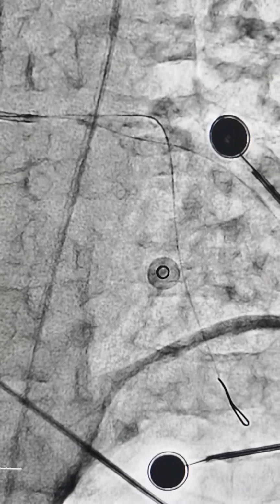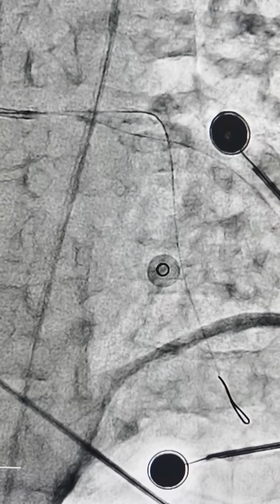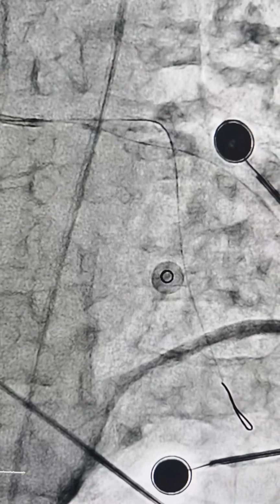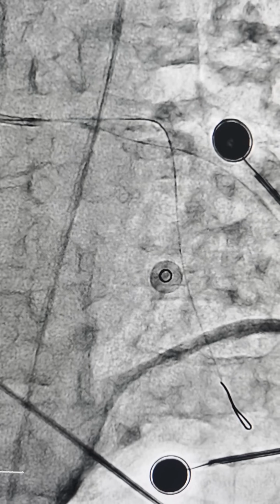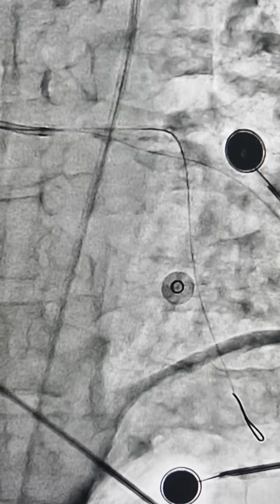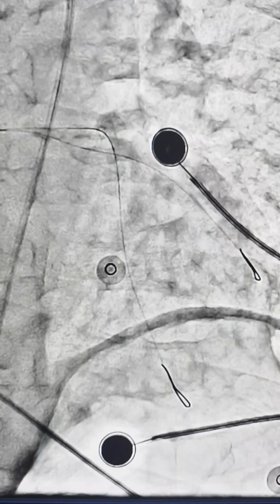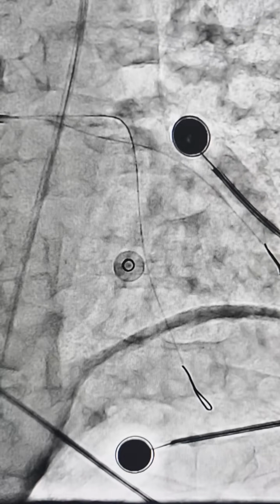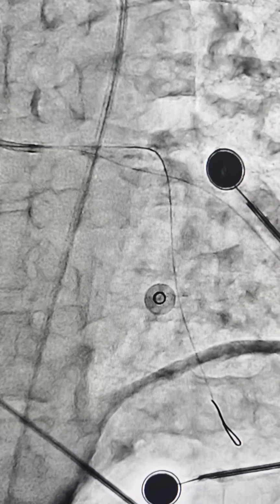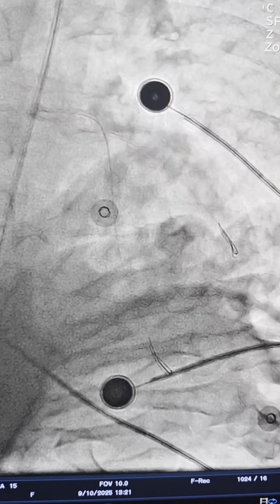We intubated him, and while we were intubating, we put in a sheath, and the pressures were 60 systolic, broad complex. So I quickly intubated him, and these were the wires, two wires. You can see that the heart is at a standstill, and the CPR is going on. So this is CPR going on at the moment, and his heart is not moving.